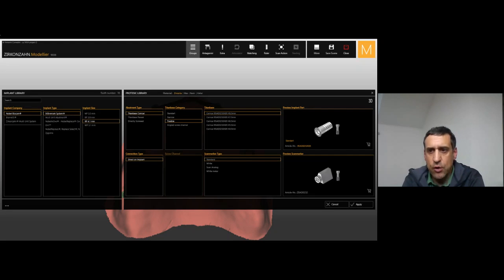Okay, so then we are coming to the new T-bases. The bases that we have seen till now were the regular T-bases that we have had available for a long time. Now we are coming to the new T-bases that were implemented one to two years ago.